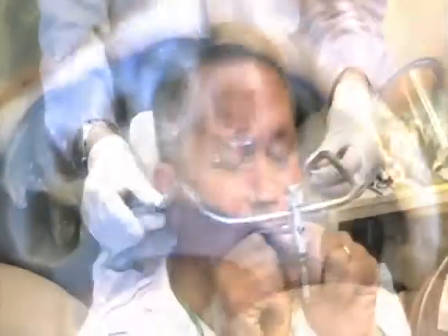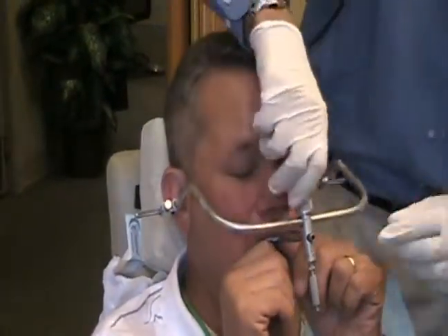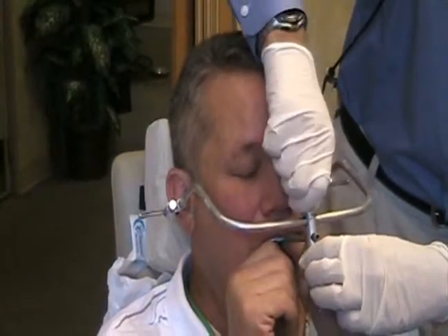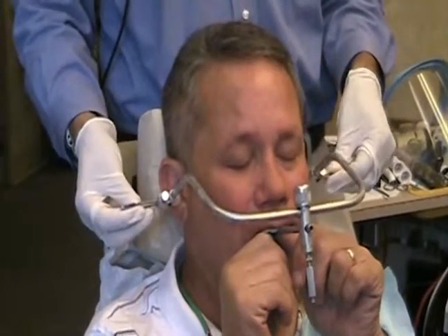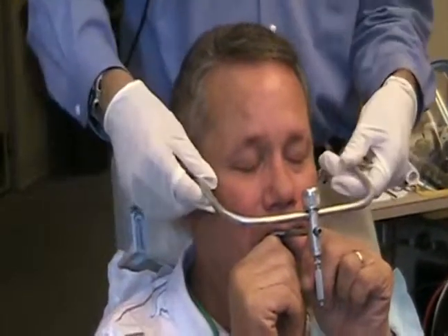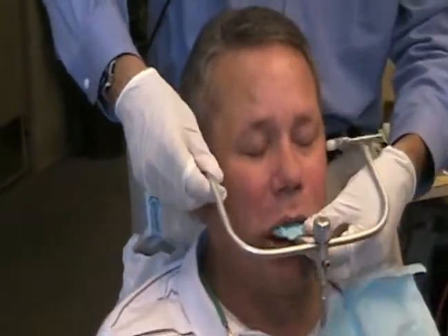So that's in the interim here. We're also going to do a face bow transfer. What that does is relate the patient's mouth to a machine that will reproduce jaw movements. They'll do that during the lab process.